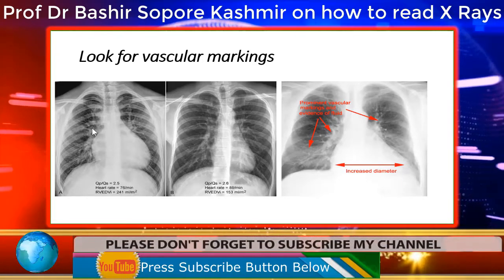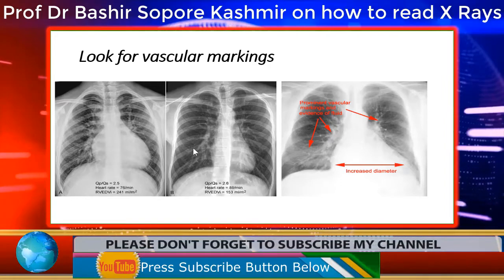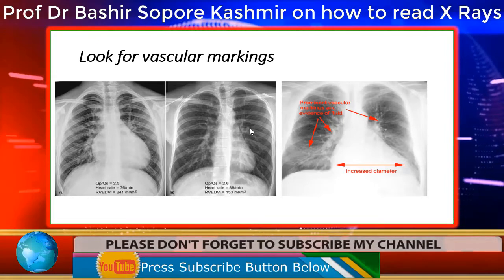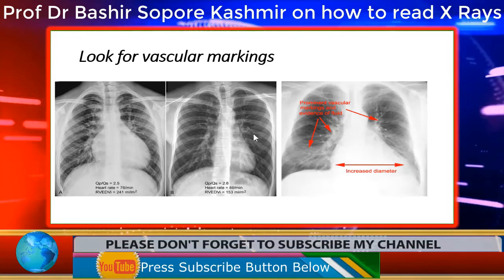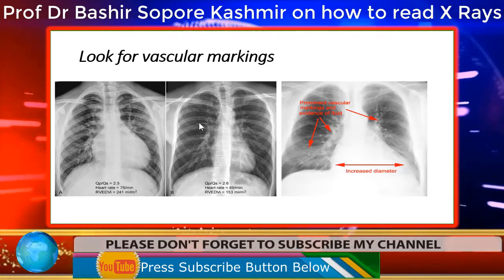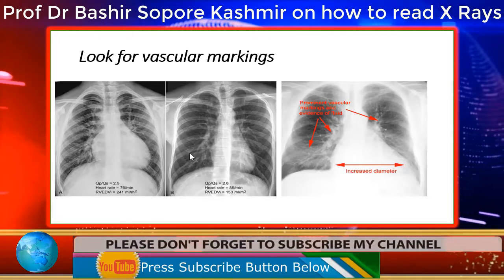Now if you see here, these are the vascular markings, these small linear striations you can see here. These are called vascular markings because the pulmonary arteries and pulmonary veins divide and redivide, so they form the network of vessels all around the lung. So these can be seen as vascular markings.